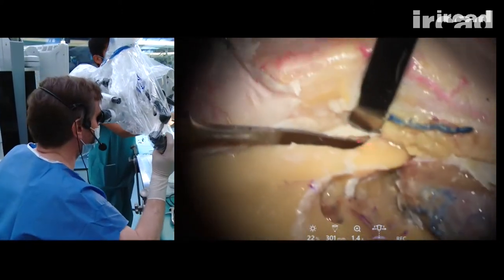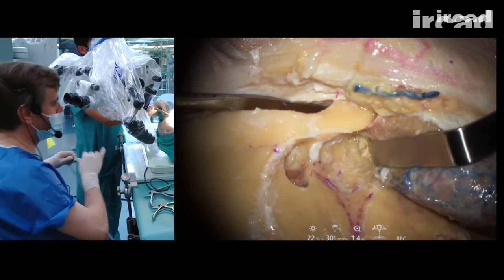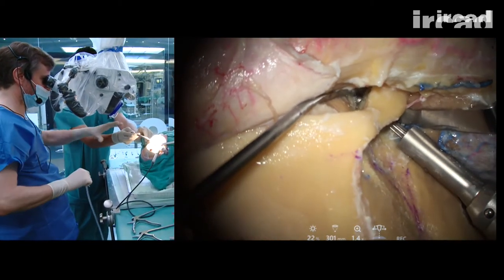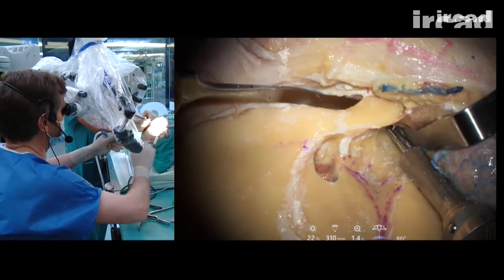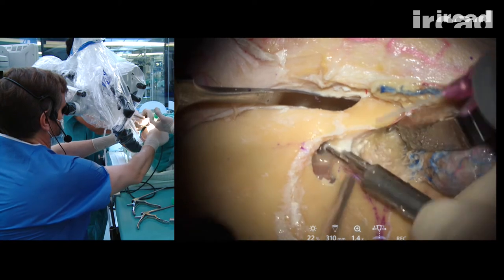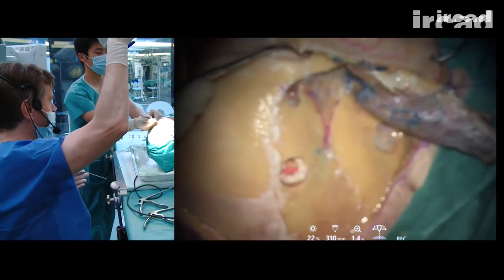And now I need to place the B1 foot plate here through the inferior orbital fissure, sorry, here this way. You just check that the dissector is protecting the periorbita like this. And then I can directly cut towards the orbital aspect. So I have cut the lateral aspect of the orbit.